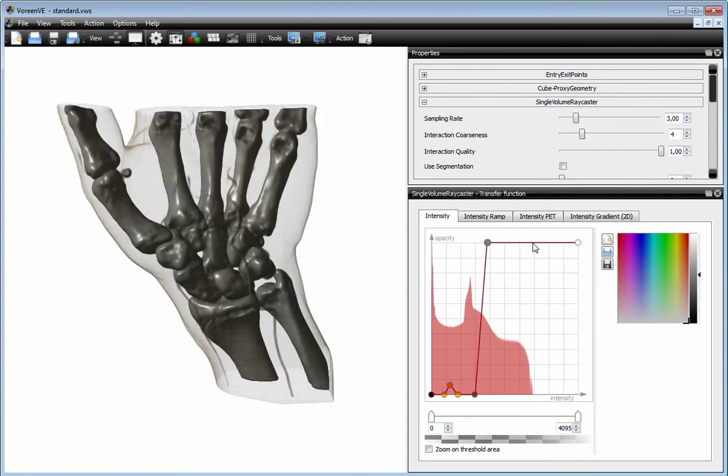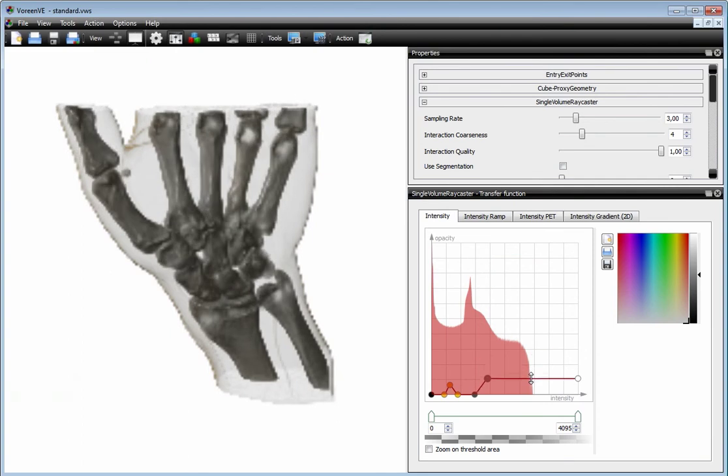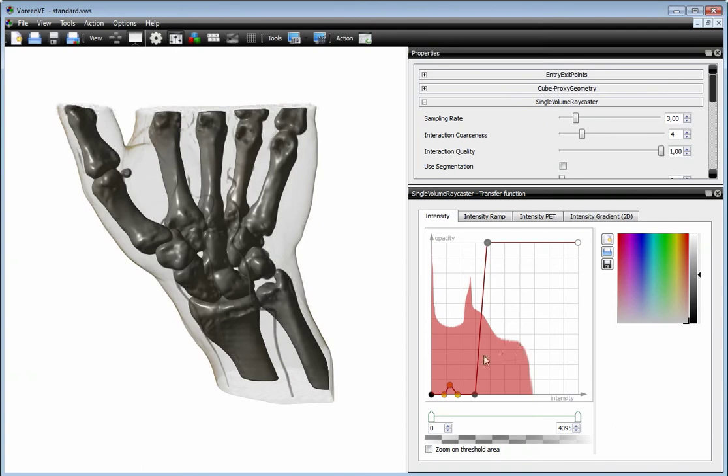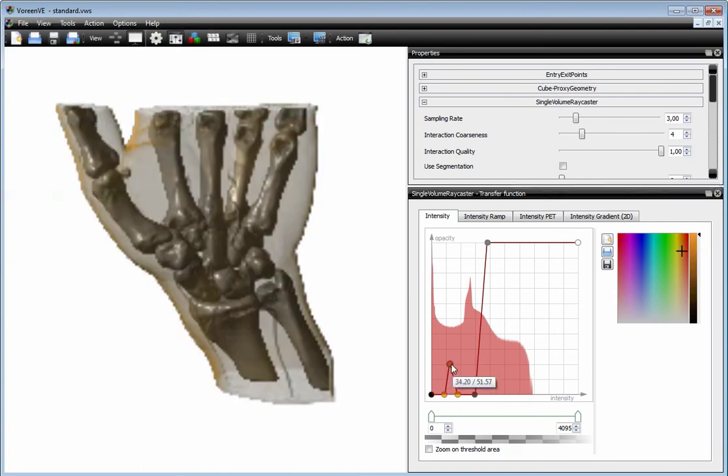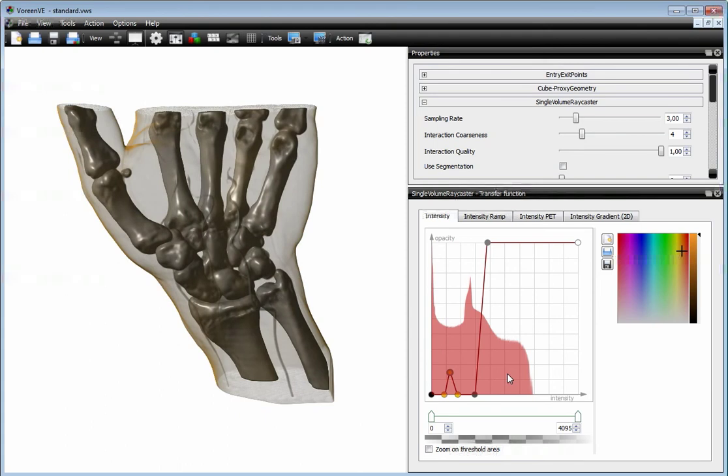It's the same you can do when you click on a line. So this is the 1D Transfer Function, which you can also export and load later on.